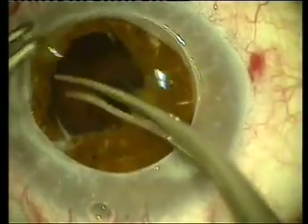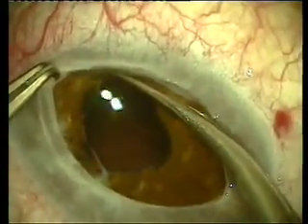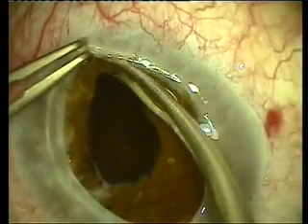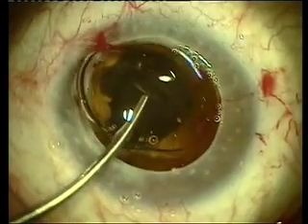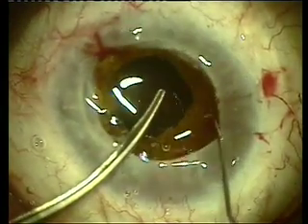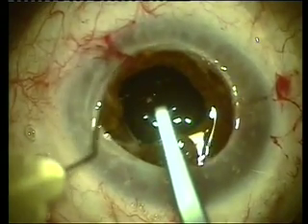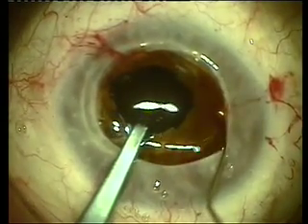As you can see here, we're going to pull back very gently the synechiae of the iris and the peripheral cornea in order to maximize the outflow that this patient can have. Here we're going to place the Artisan Oversize Aphakia lens over the iris and fixate it into position, enclaving it with the special enclavation needles as you can see here.